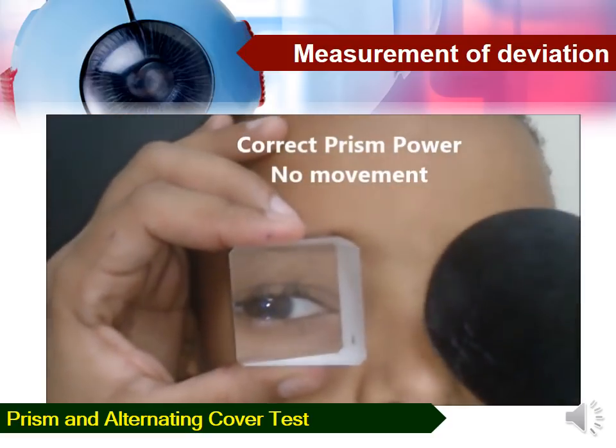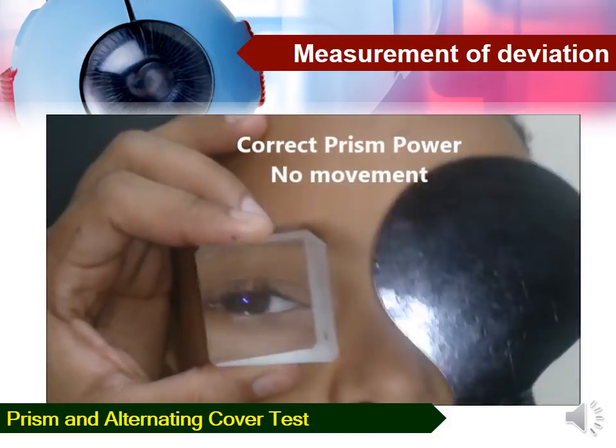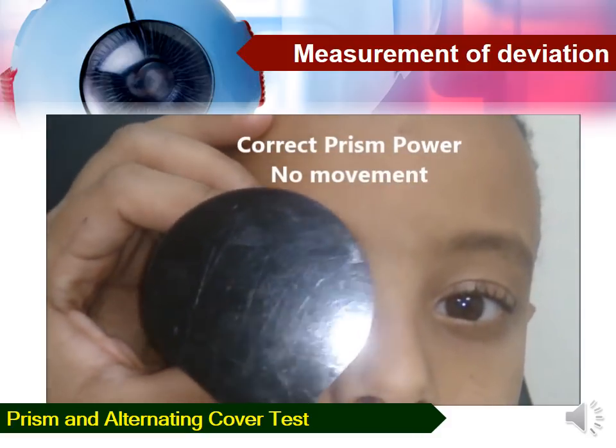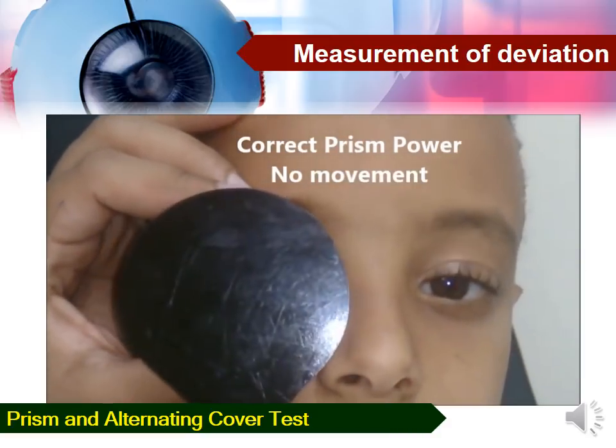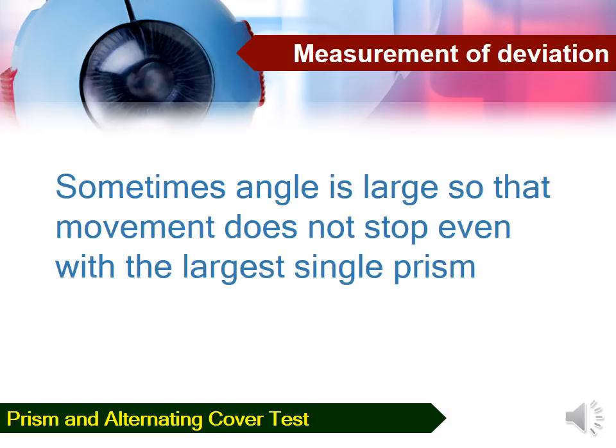So you need to place a prism of larger power. Usually a separate prism of larger power is available. At the correct prism power, there is no movement of the eye. Sometimes the angle is too large, so the movement does not stop even with the largest single prism.